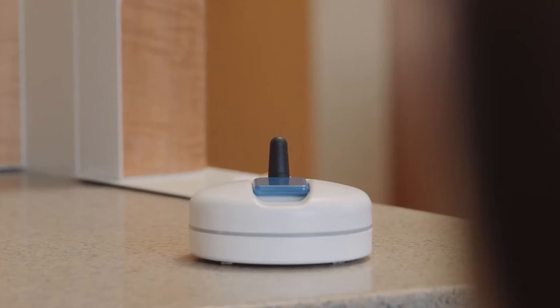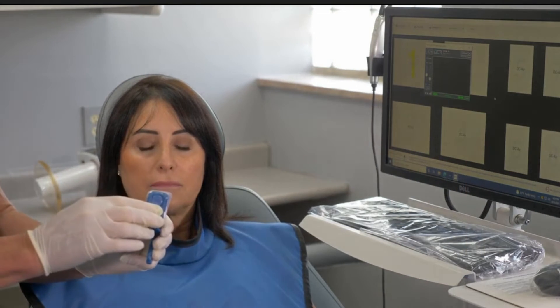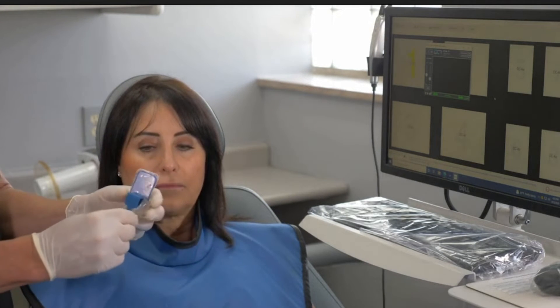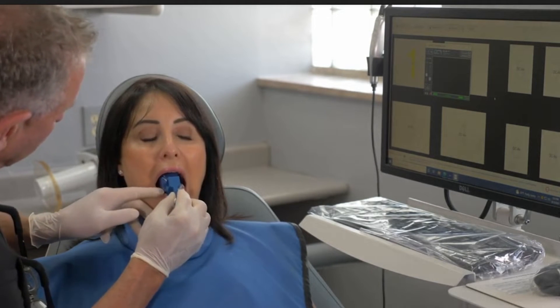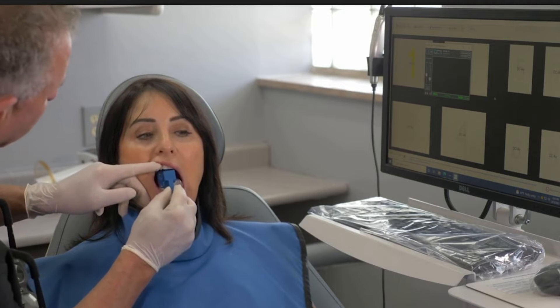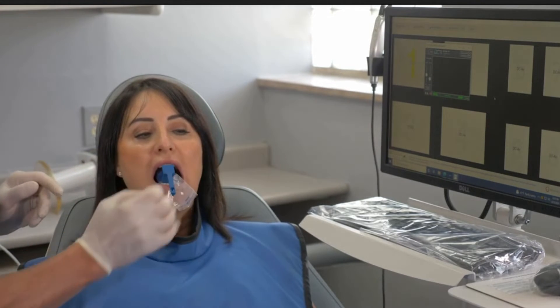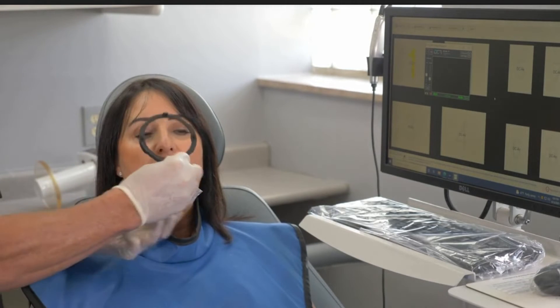Now let me share with you the DCR or wireless x-ray sensor. It is a revolutionary change in digital x-ray. The DCR uses the latest Bluetooth technology for fast and reliable image transmission, eliminating the main sensor failure point of traditional sensors: the wire. Wireless technology is more durable, easier to position, and more portable. This wireless sensor enhances workflow productivity and patient comfort. No more fiddling around with cotton balls or moving the wire around during imaging exams. The DCR is a true innovation in digital x-ray sensors and will last two to three times longer than a wired sensor.